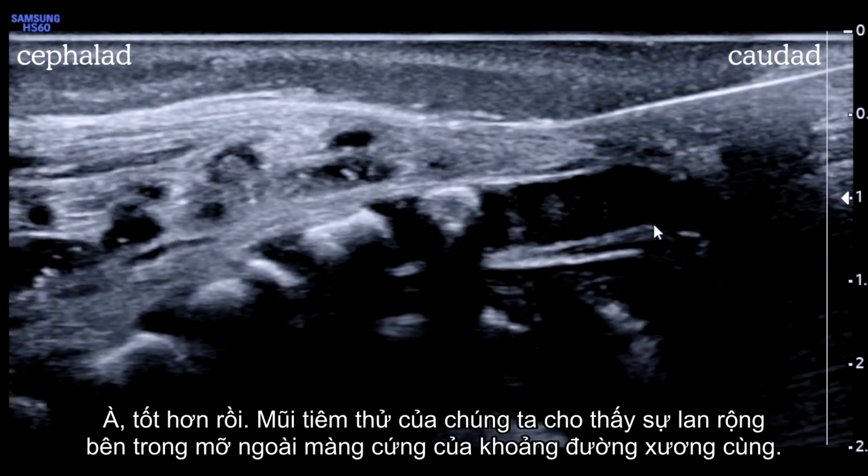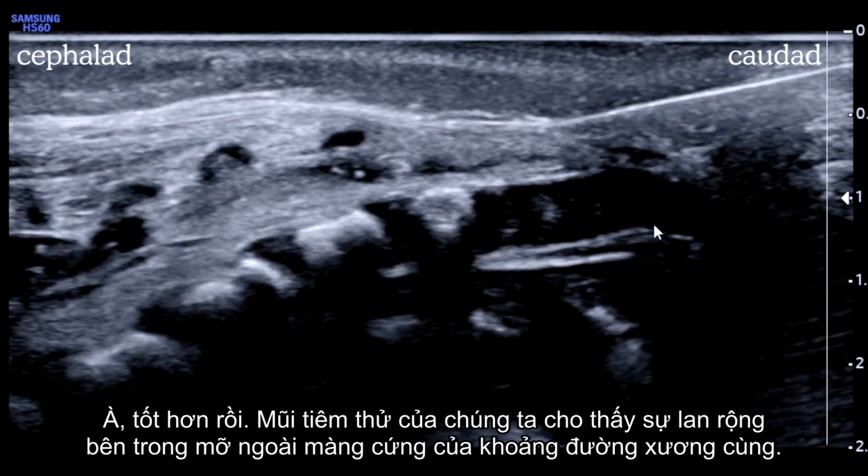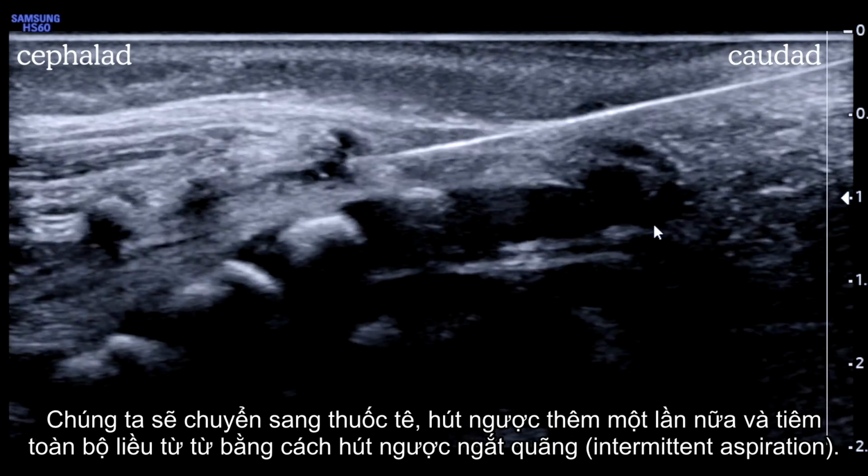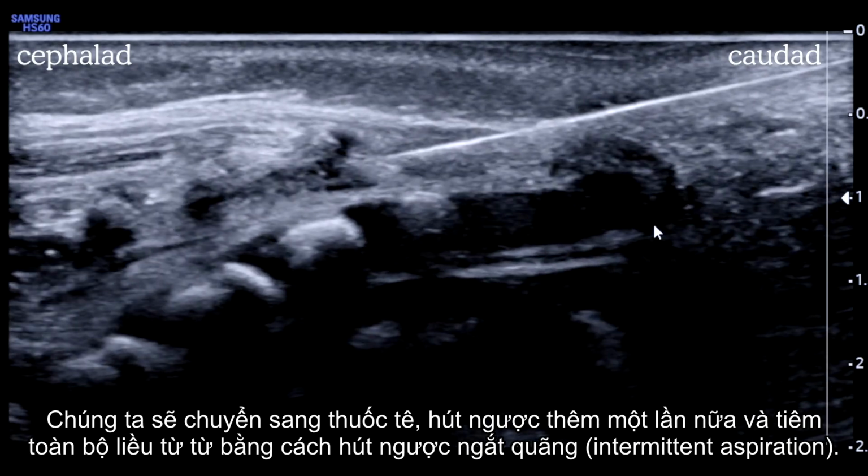That's better. Our test injection shows expansion within the epidural fat of the caudal space. We'll switch to our local anesthetic, aspirate one more time, and administer the full dose slowly using intermittent aspiration.